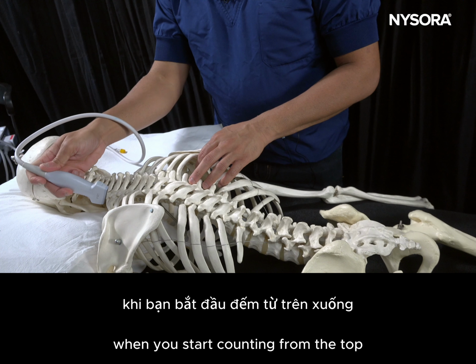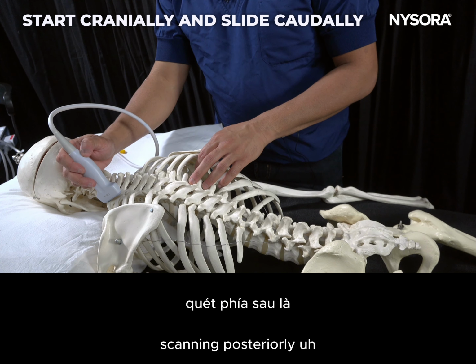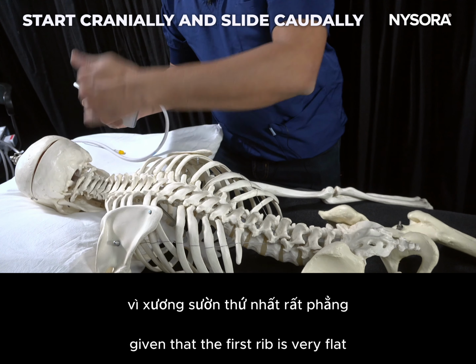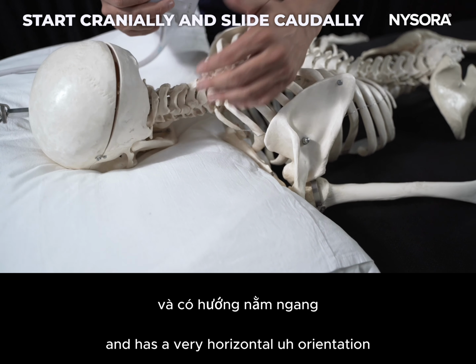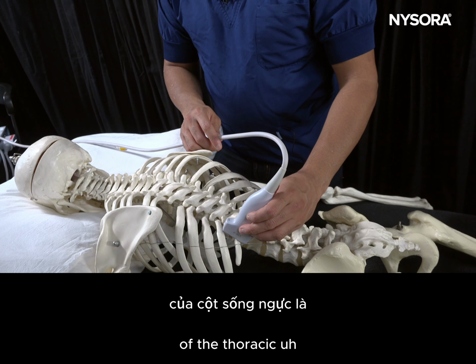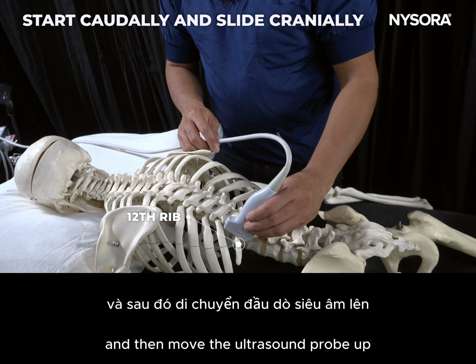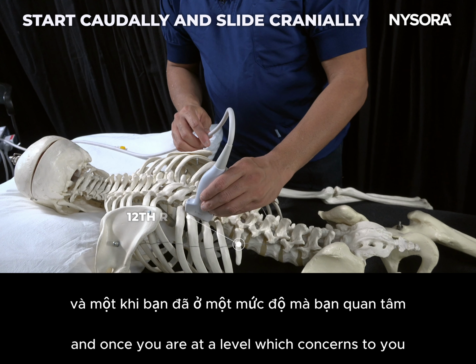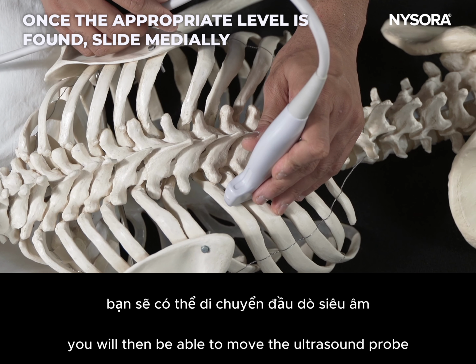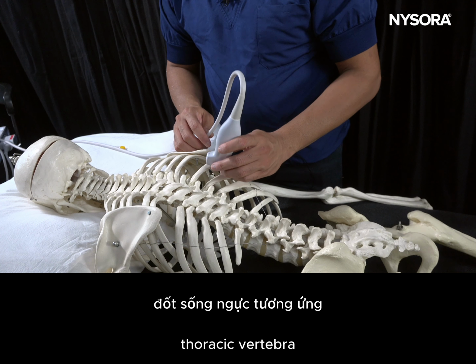When you start counting from the top, the first structure that you'll be able to see on the scanning posteriorly will be the second rib, given that the first rib is very flat and has a very horizontal orientation. The other way to calculate the thoracic levels would be to start at the 12th rib and then move the ultrasound probe up. And once you are at a level which concerns you, you will then be able to move the ultrasound probe medially, and that will take you to the corresponding thoracic vertebra.